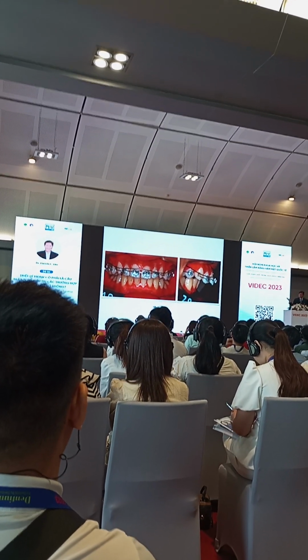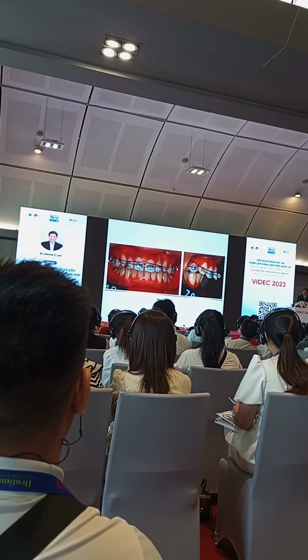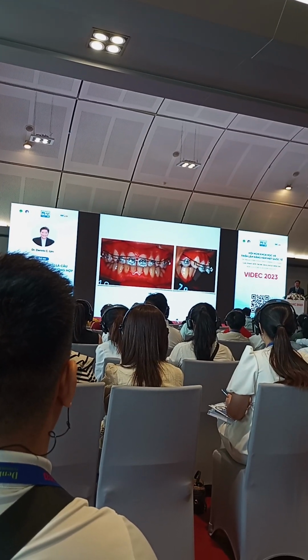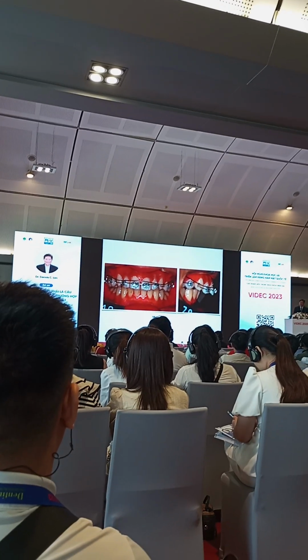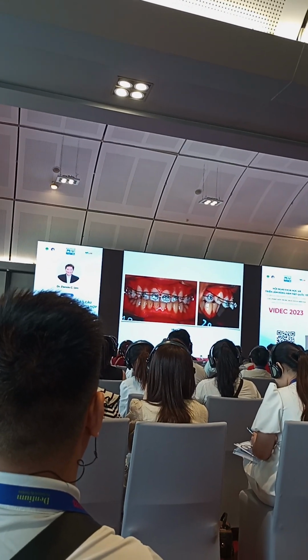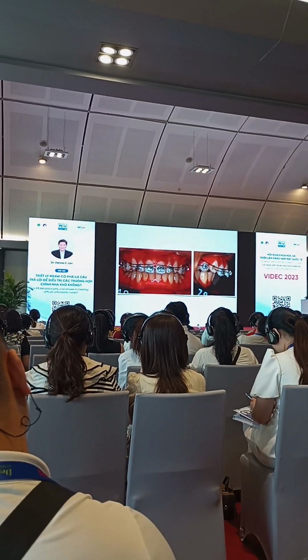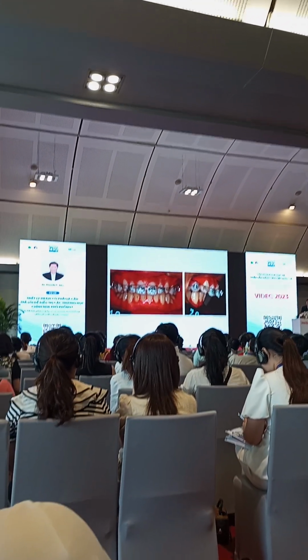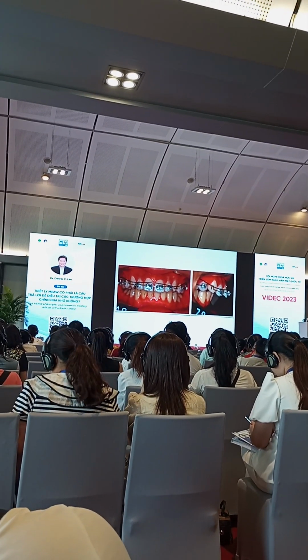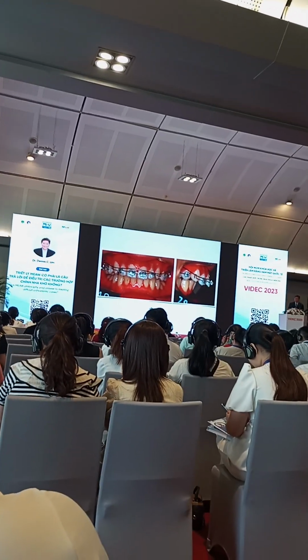This was during the time when implants were not yet available. So we had to make use of the different mechanics available to us to correct the deep bite. But nowadays, we are lucky that we have a lot of accessory orthodontic materials, especially implants, that help us in our treatment mechanics.